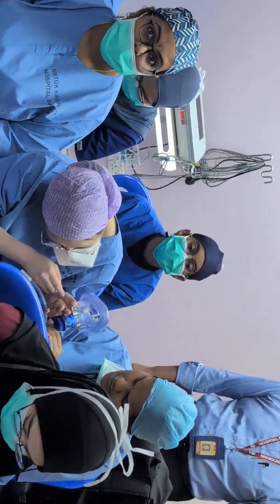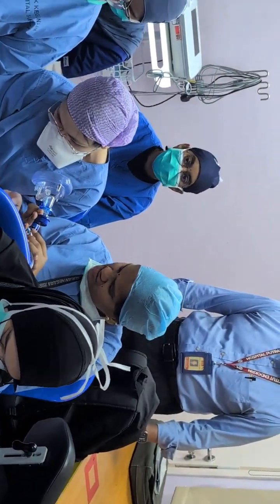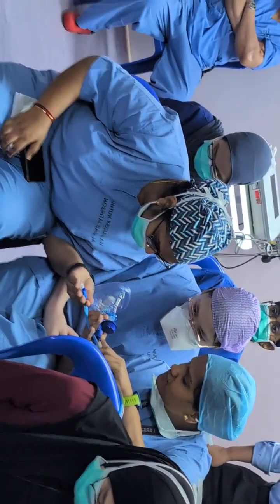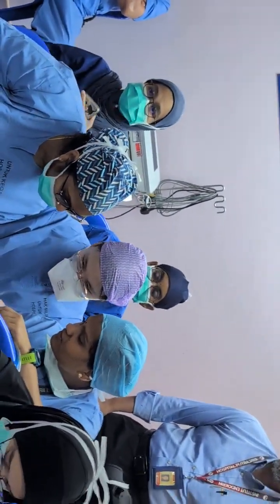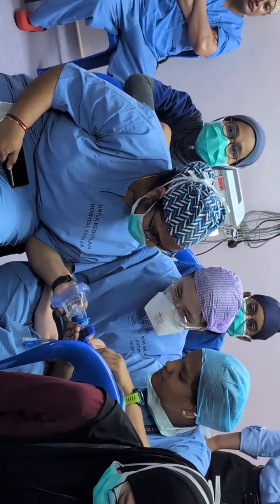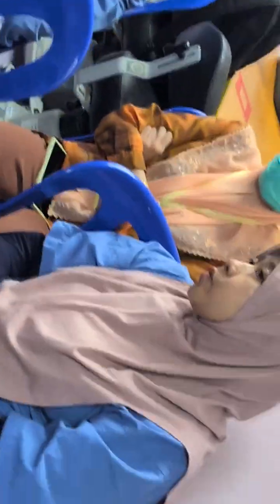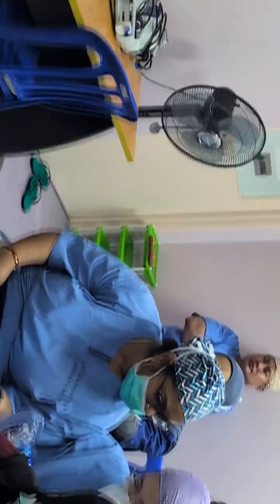Okay, the reason, doctor, let me go back to the pre-hospital care tadi. Now, this does not happen here, but for me to explain, that is the best way. So doctor, if the patient is on this, kita nak ambil history from the patient, it's almost impossible. Patient is not going to open his mouth and talk, because CPAP just pumps you with air. You like it, you don't like it, CPAP just going to pump you with air. Hence, doctor, this is the balloon.